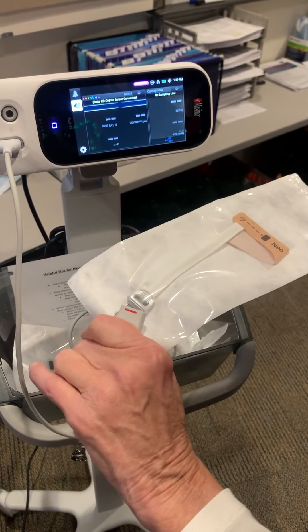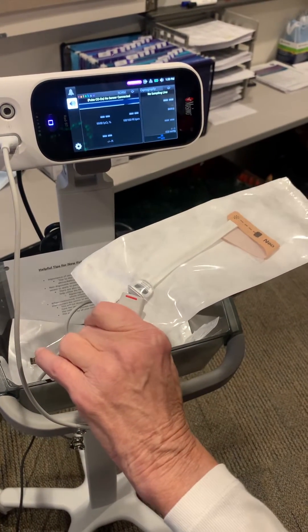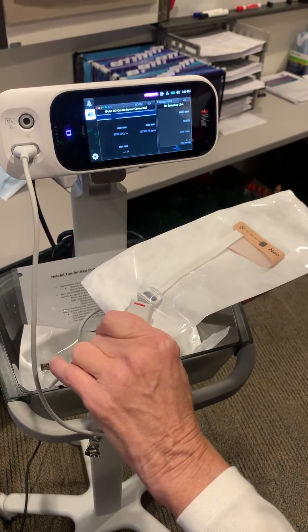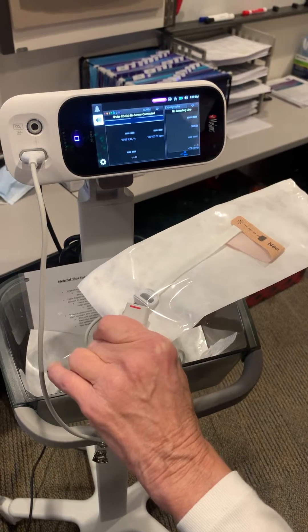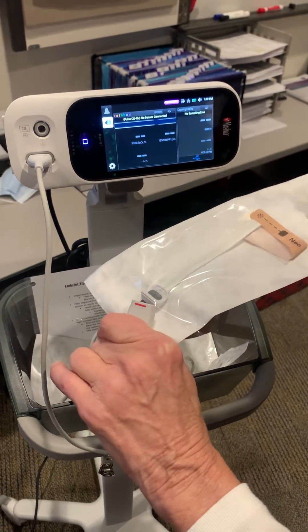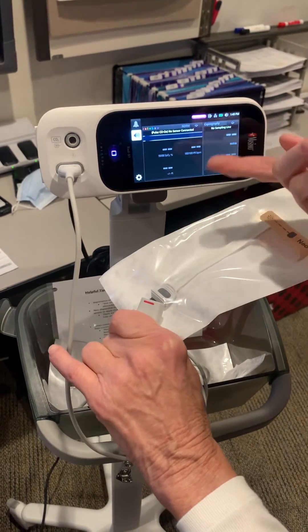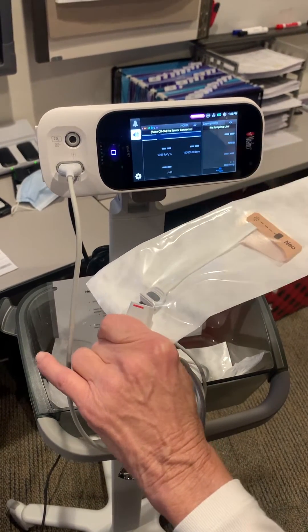We want to leave these on and plugged in at all times, because it does take a while for it to turn on and do its self-test, so you don't have to wait — we'll just leave them on. After you do your test, the information will show up right here.